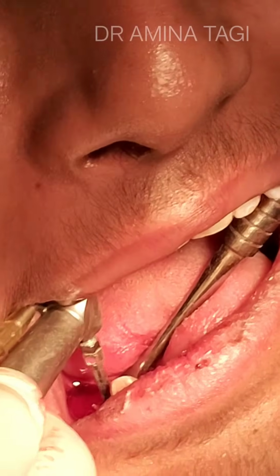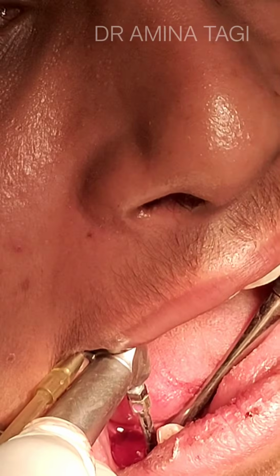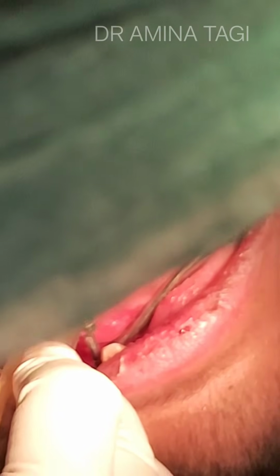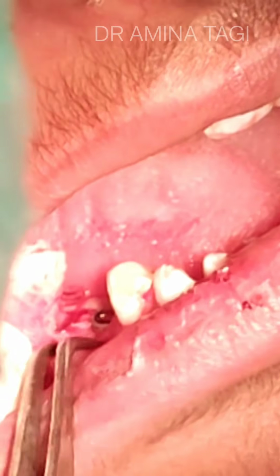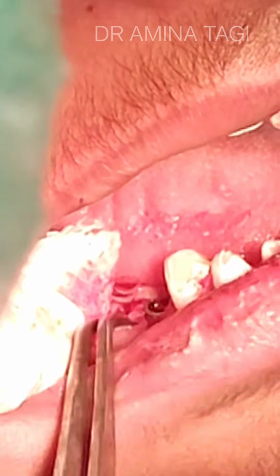Even after increasing the torque, I encounter significant amount of resistance while trying to insert the implant. So sometimes what happens is that in very dense bone like mandible, there is difficulty in insertion. The implant was not being embedded fully below the crestal level, or at least at the crestal level. You can see in the video, the implant is way too above the crestal level. In dense bone like mandible, difficulty in insertion somehow does occur with handpiece.